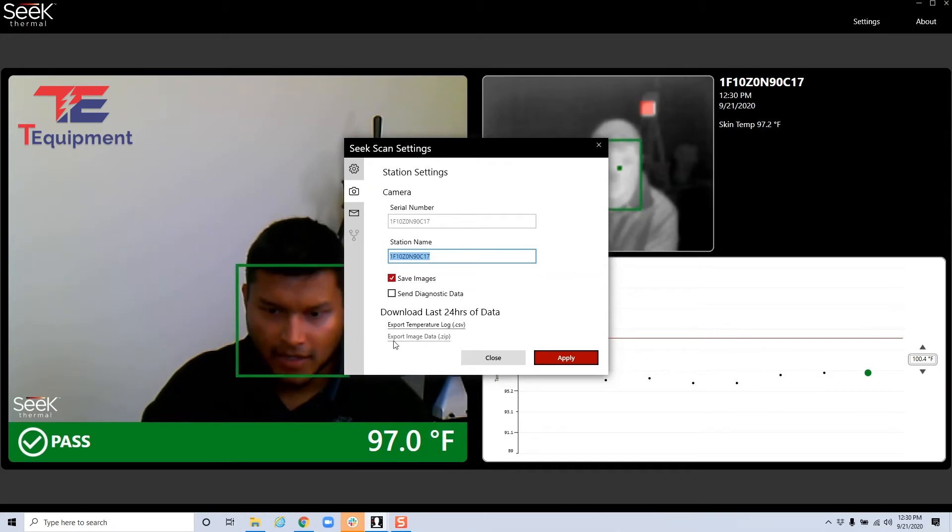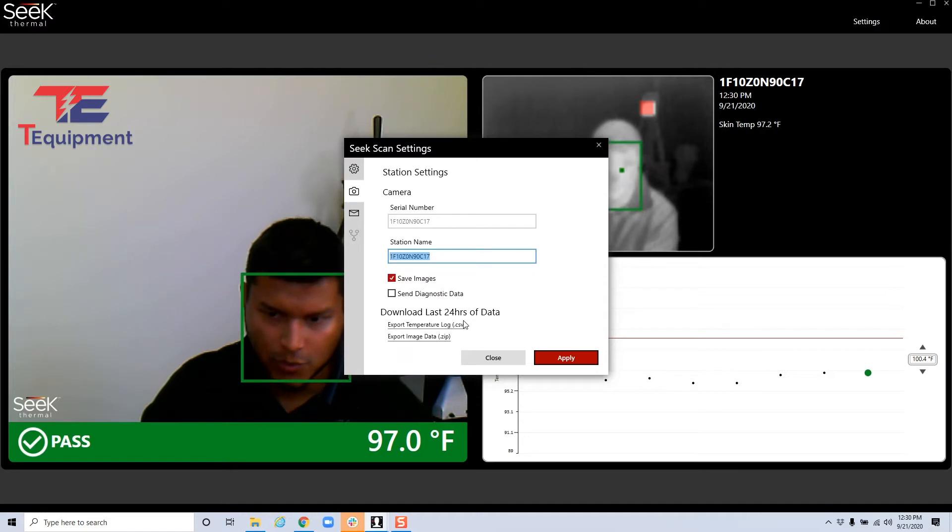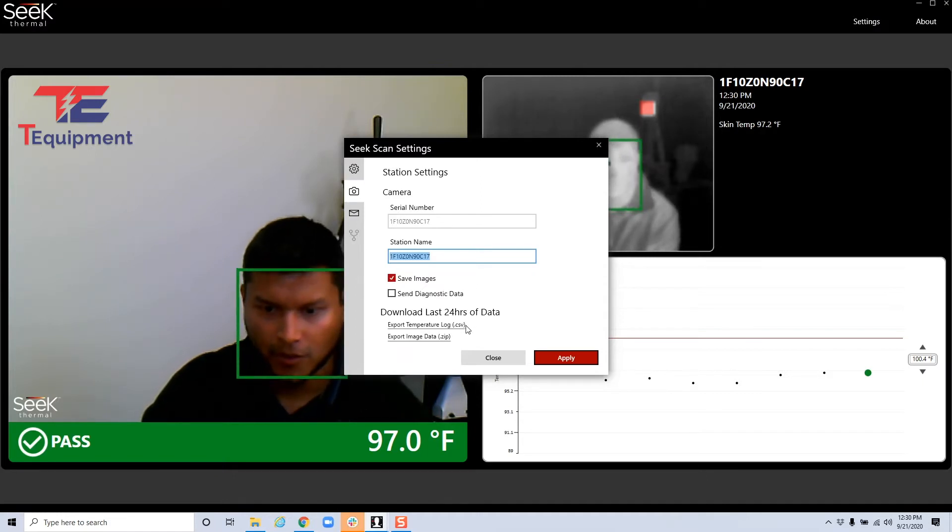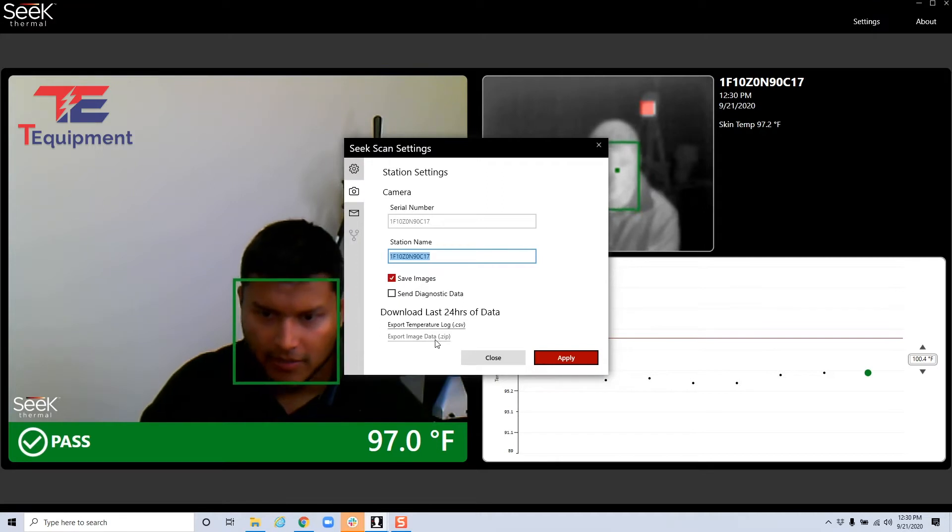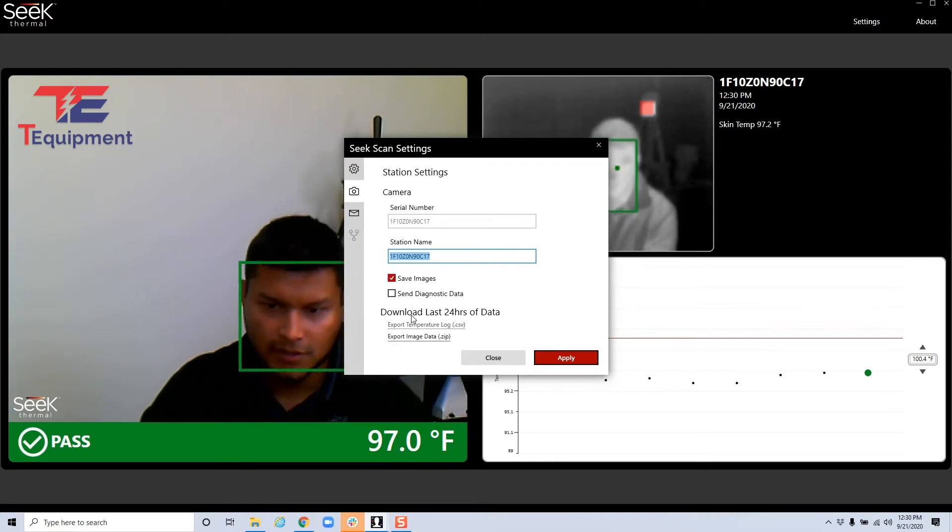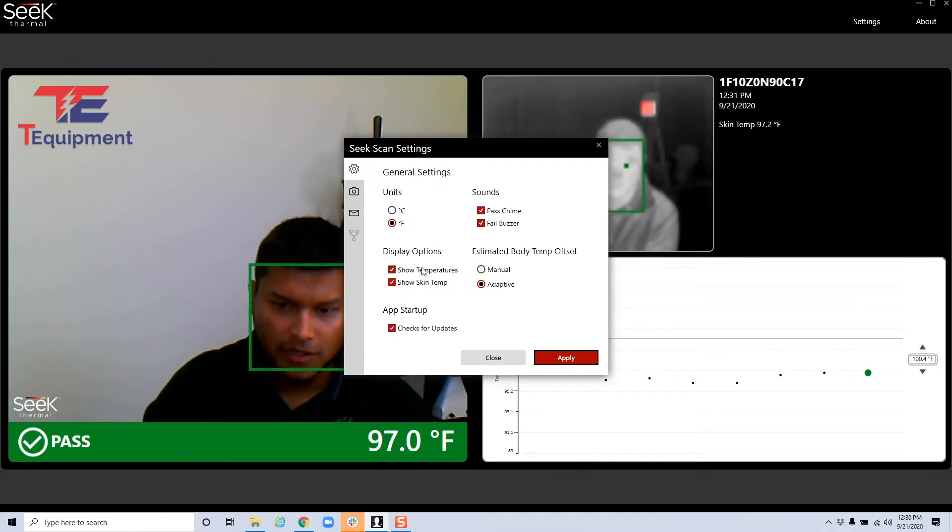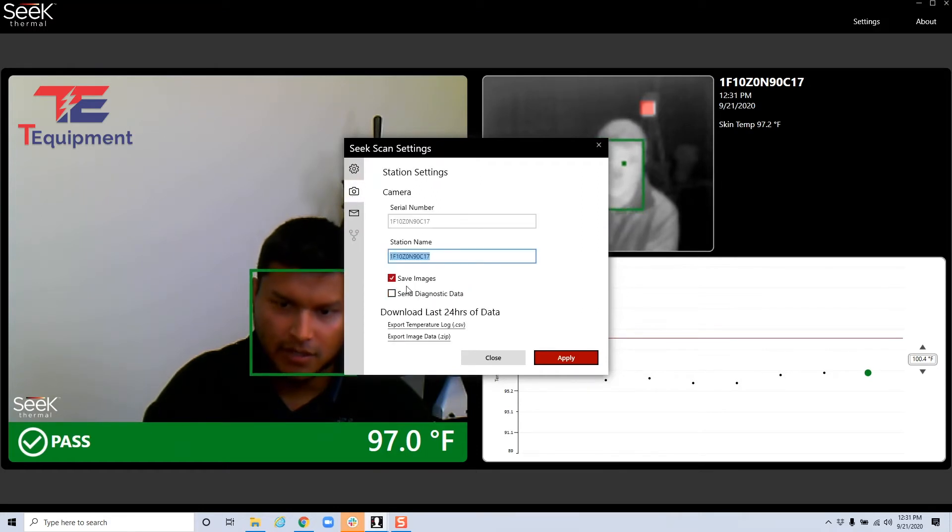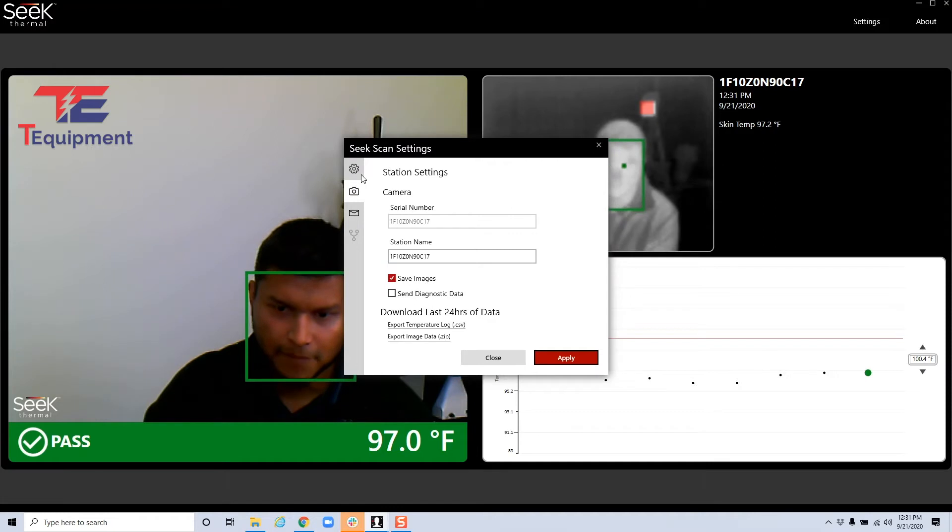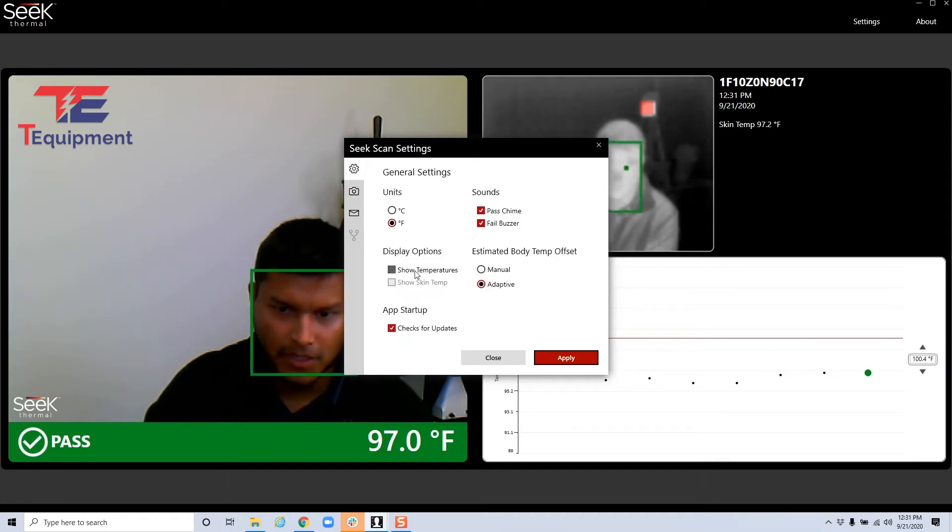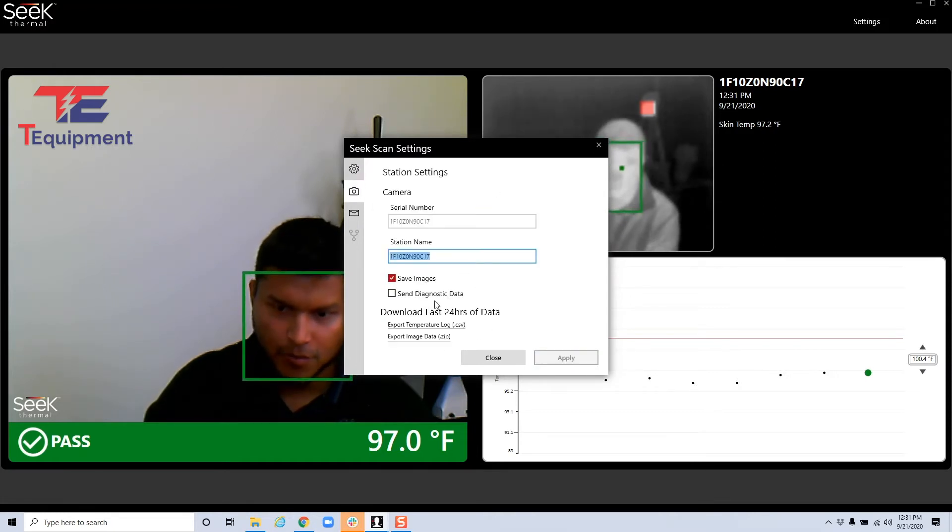And there are actually two options now to export data, last 24 hours of your log plus your image data itself. So basically the pictures, these are encrypted, which is a nice touch here. If you don't want to show temperature for privacy and you don't want to save images, you can actually do all of that. So depending on your compliance settings, you'll be able to control that.